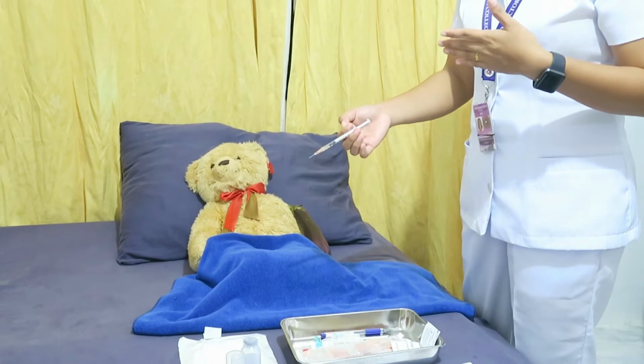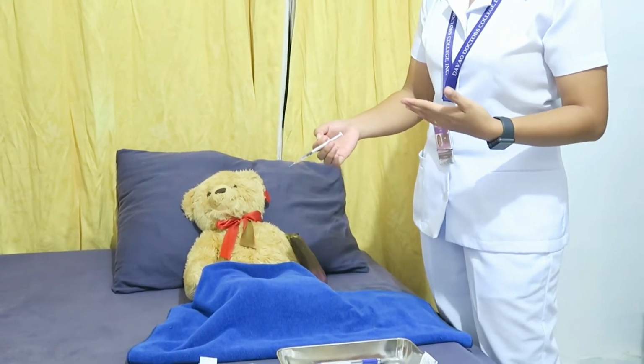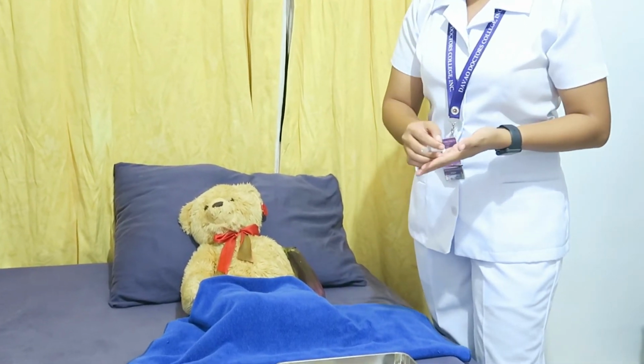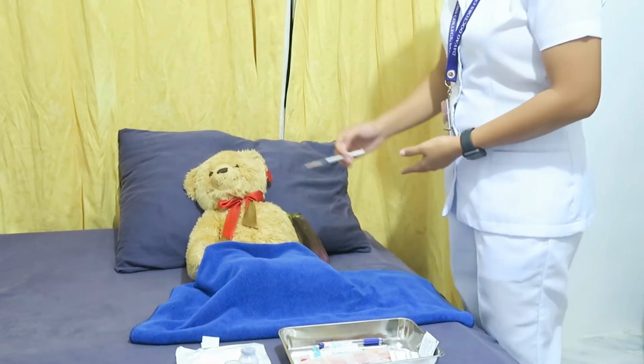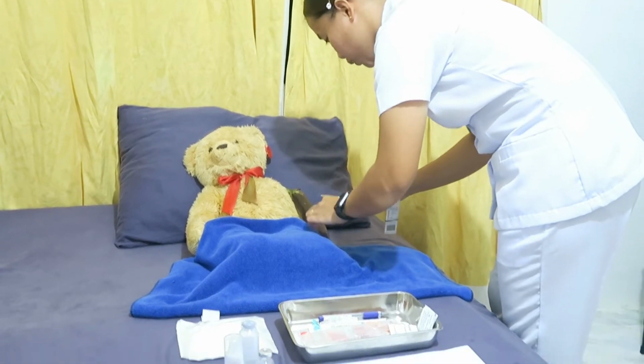Stabilize the syringe and needle and inject the medication carefully and slowly so that it produces a small wheal on the skin. The rationale for that procedure is to verify that the medication entered the dermis. Ma'am, mag-inject na po ako ha. Ma'am, thank you.